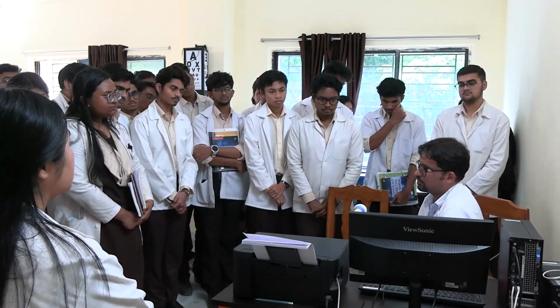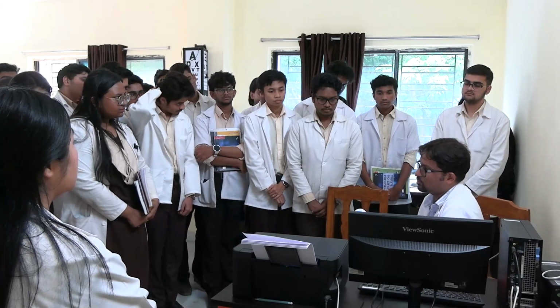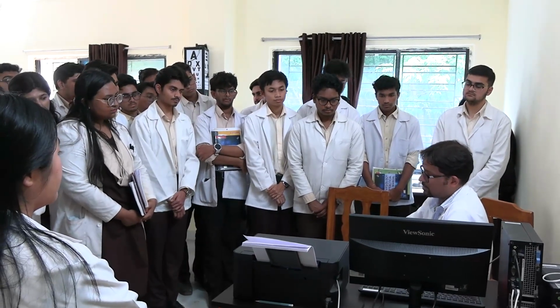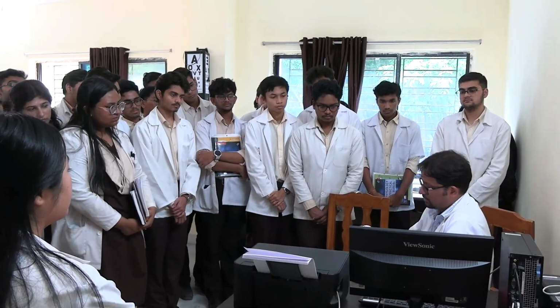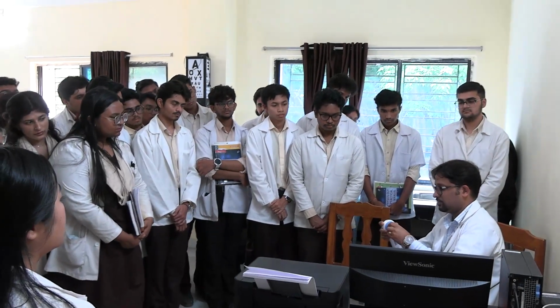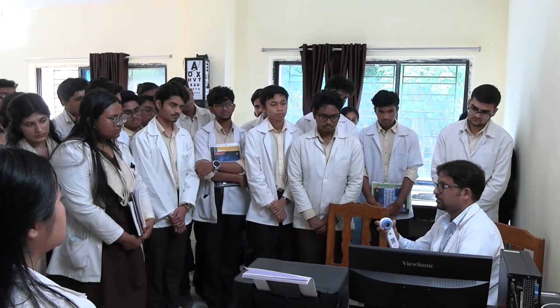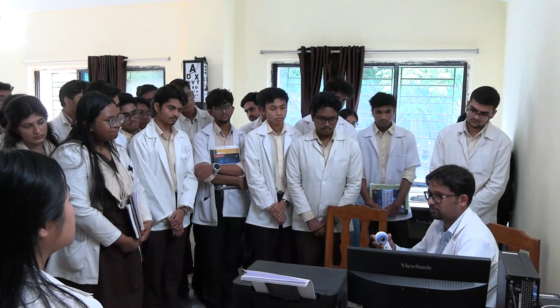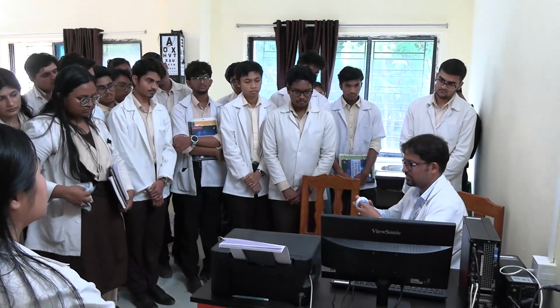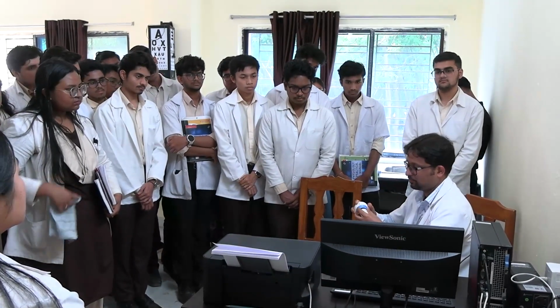So there are various models of digital spirometer. This is one such model. Now what are the basic parts in this? This is, as I said, the body. This thing that you see here, which is going inside, has turbines through which the flow rates can be measured. Volume measurement is possible even in very simple setups like you have seen there.